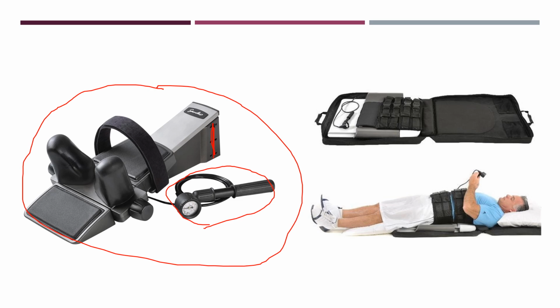And that'll really help determine what segment of the cervical spine you're going to be treating. So at the lowest setting, you're going to be treating more of the upper cervical spine. If the head is in more of a neutral position, you're going to be tractioning C1, C2, C3, kind of that upper region. The more flexion you have whenever you're performing cervical traction, the lower the level on the cervical spine you're going to target. So like C5, C6, C7.